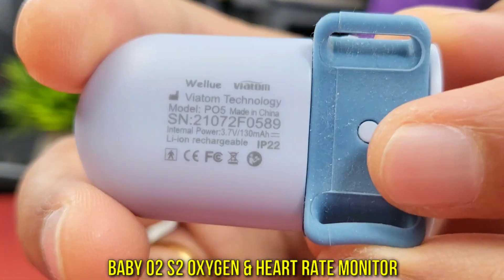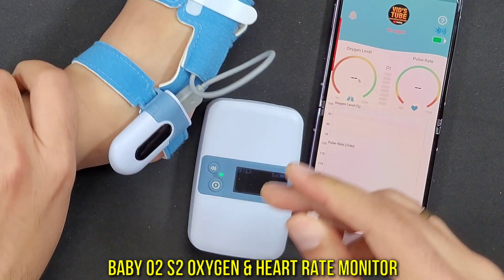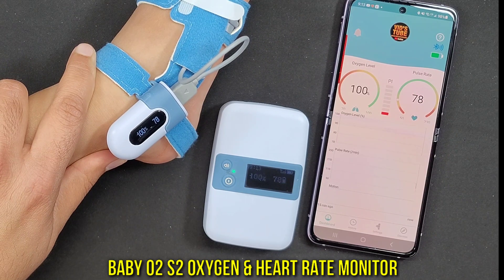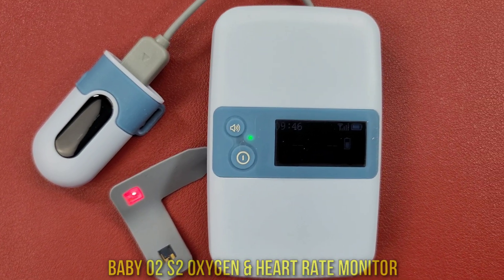They sent out another cool product to check out — it's the Baby O2 S2 oxygen monitor, powered by Viatom Technology. This device can remotely measure your baby's heart rate, oxygen, and motion data, and it can remotely alert you if there are any abrupt changes to the set limit.